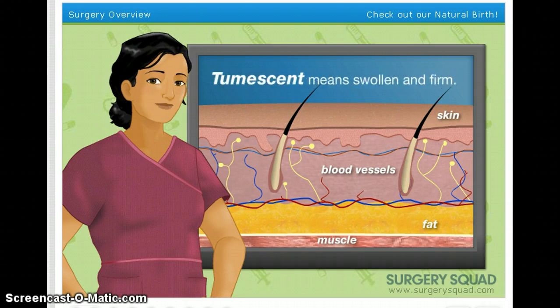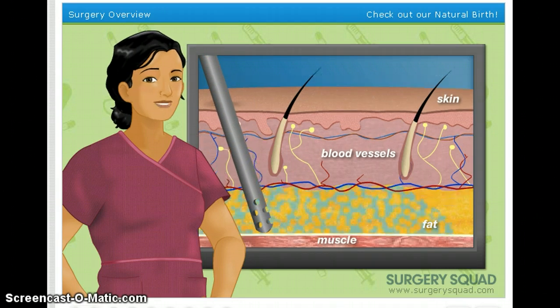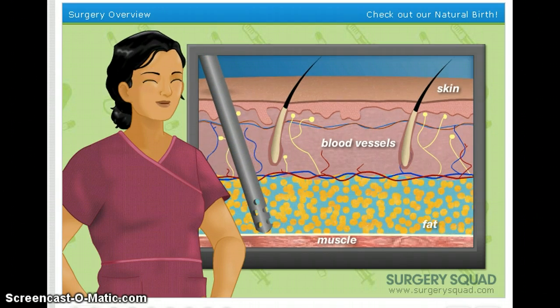The word tumescent means swollen and firm, and with this technique we'll be injecting such a large volume of the fluid into the fat deposits that our patient's abdomen literally becomes tumescent.